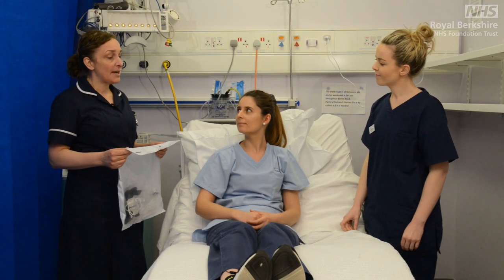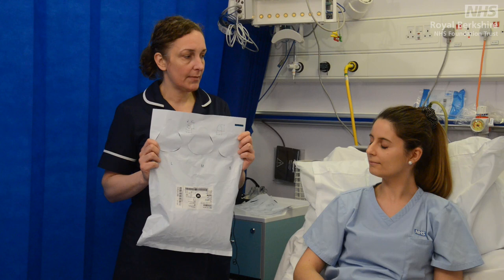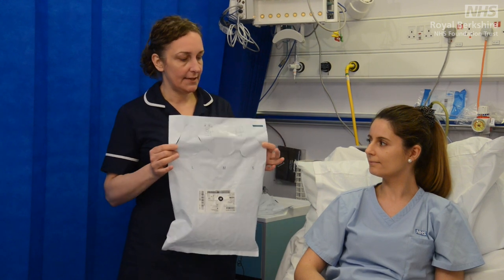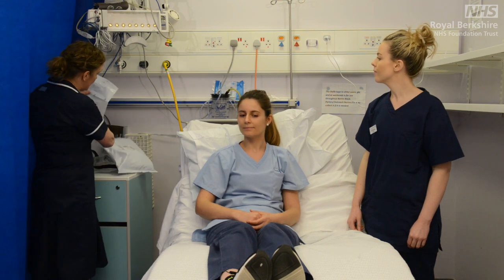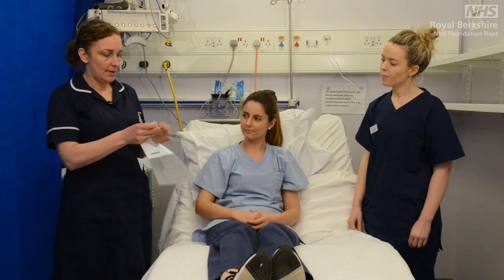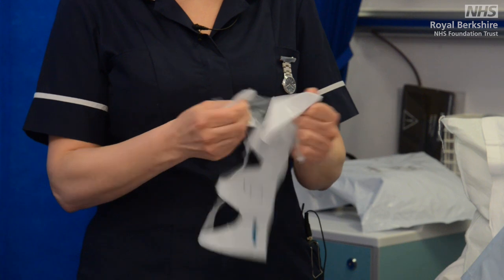So Kerry, the first thing we need to do is make sure that we've got the right size mask for our patient. We've already collected our mask in its packaging from the cupboard, and as you can see just along the top here we've actually got three different sizes — these are three different templates: small, medium and large. So we're going to pop these out to reveal the templates for the mask fitting.